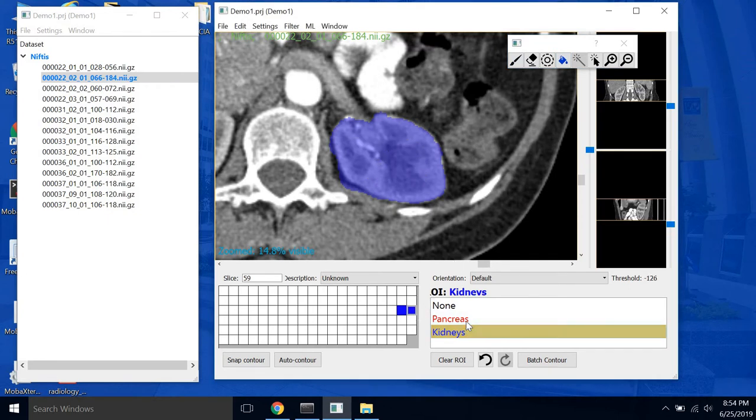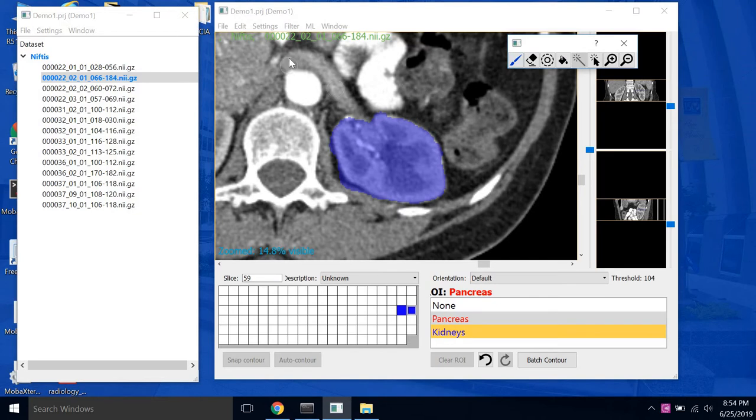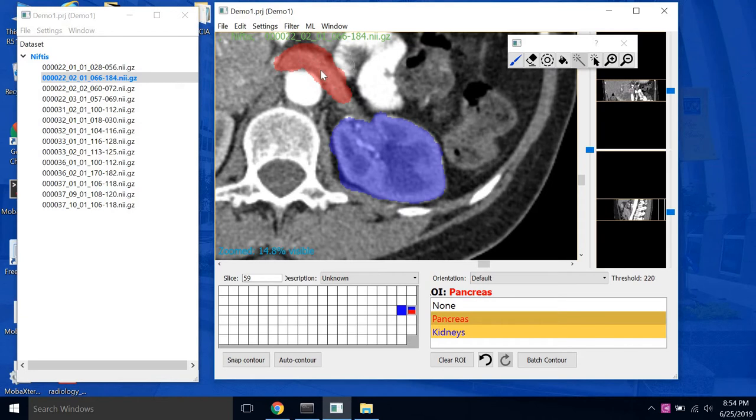And if we want to select a new ROI, just click on pancreas. And we can trace out. This is terrible anatomy because this actually is not the pancreas, I don't think. But it gives you the idea.